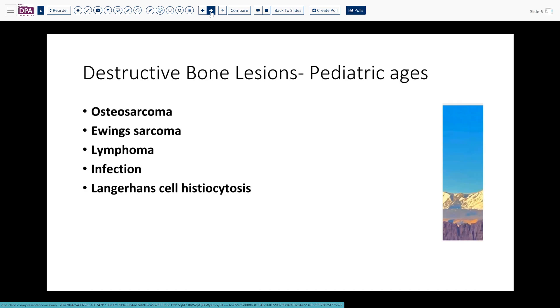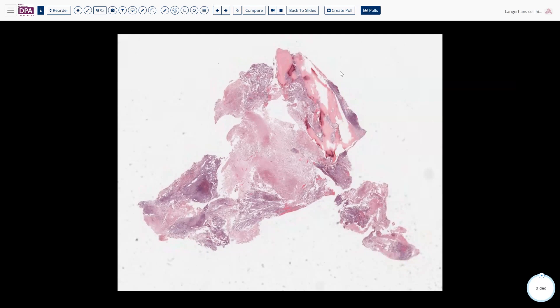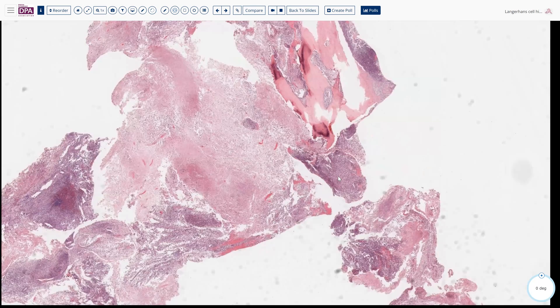With that differential in mind, each would require biopsy or evaluation. Biopsy was obtained with frozen section evaluation. The representative section shows cortical bone with permeation and destruction, variable pale necrotic areas, and bluer, more cellular areas. Let's look at one of the bluer areas.